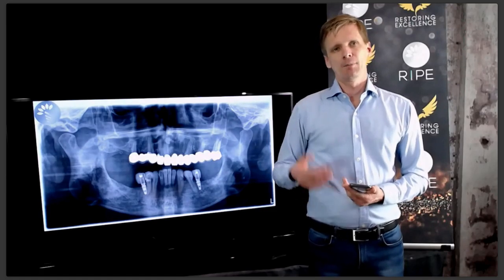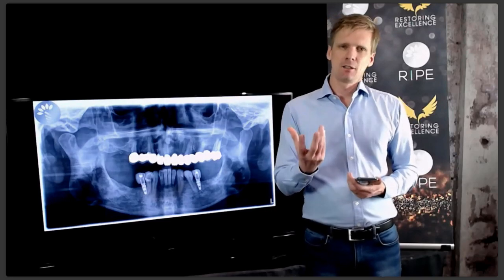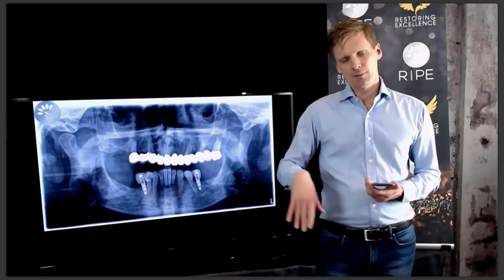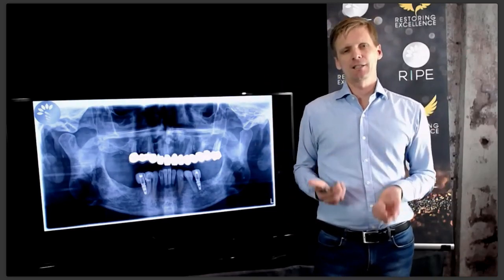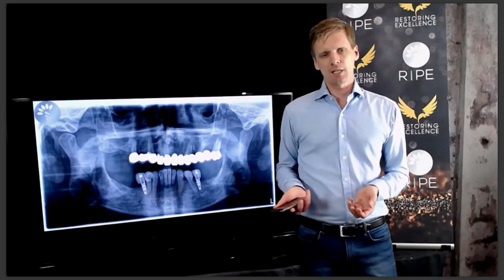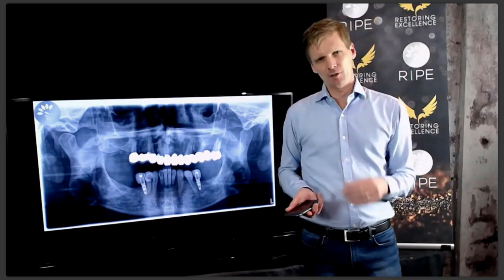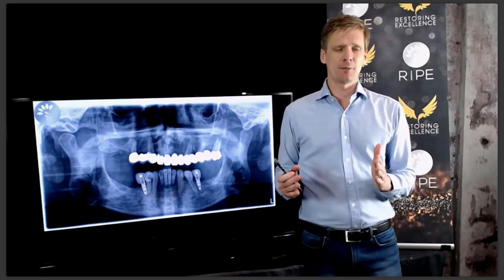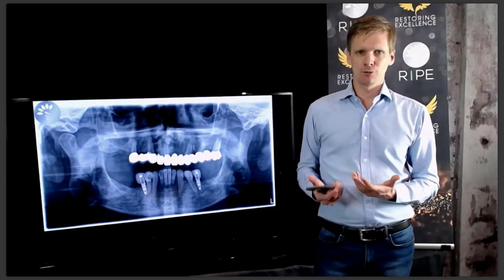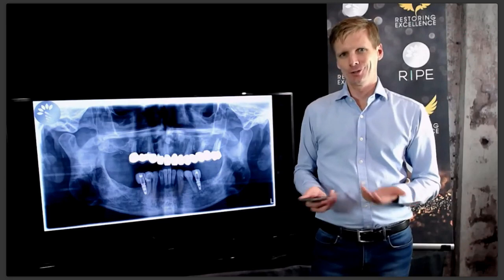And I will do it freehand, but I have done this many times, so I can kind of see how much I need to add on to the teeth. I find that when I use stents, you get slightly more precision, but then you spend about 10 times longer fixing all the interproximal areas, because it's much harder to control the interproximal excess when you use a stent. I have tried using Enrique Guzman's technique of the clear stent with flowable, but the flowable chips a lot. And once again, you end up with a lot of excess you've got to clean up. So I found it easier just to do them one tooth at a time. You add length on and so on. It also teaches you a lot about occlusion, to build a case up freehand and then grind it into position and then fix up all the bits that don't look good, okay?